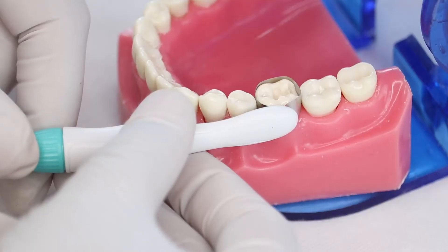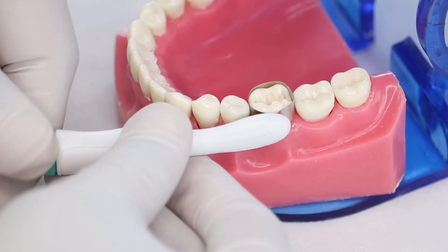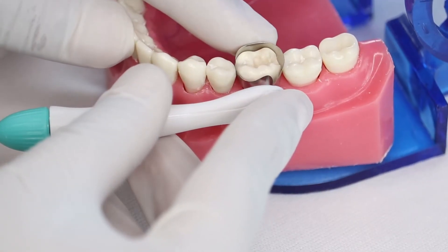To remove the band, first loosen by turning the handle two to three turns anti-clockwise, and then remove the entire unit.